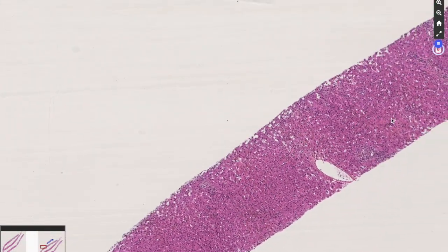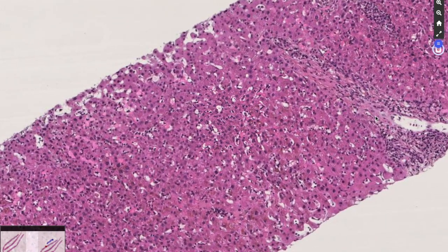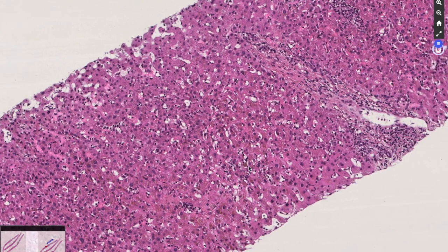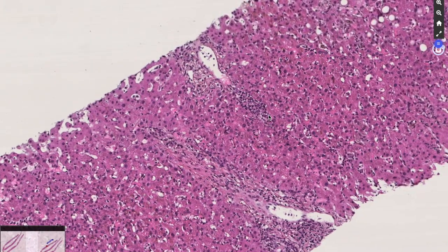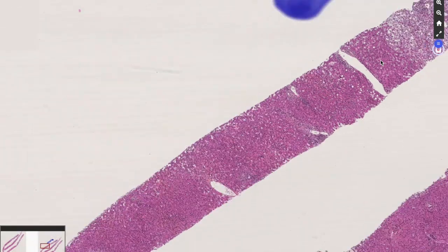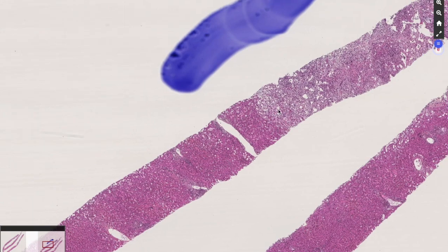When we go through this non-tumoral liver, what we can see here is a portal tract with an inflammatory infiltrate. Also here some maybe macrophages with iron, but all these changes do not seem very specific and are likely to be related to what is near. And we now are going to look at the other part of the biopsy.